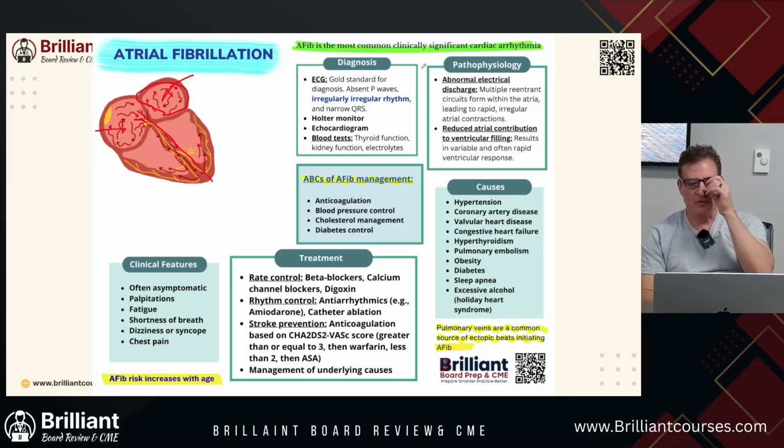It's called pulse field ablation. Instead of using heat or cold energy as in a traditional ablation, pulse field ablation, which is a catheter therapy, uses short bursts of high energy to affect the heart tissues that cause atrial fibrillation. These selective electrical pulses, primarily targeting heart muscle cells, reduce the risk of collateral damage to sensitive structures, including the esophagus, and we'll talk about why, the phrenic nerve, and blood vessels.